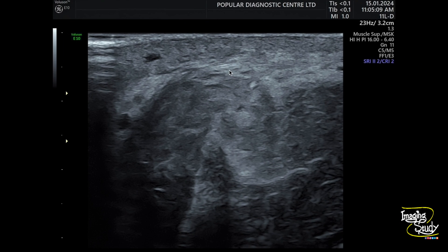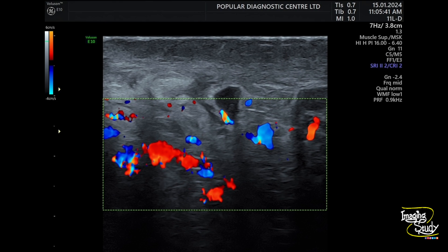Here is another view of the hematoma. And on color Doppler, you can see the surrounding thickened skin showing increased vascularity due to the inflammatory process.